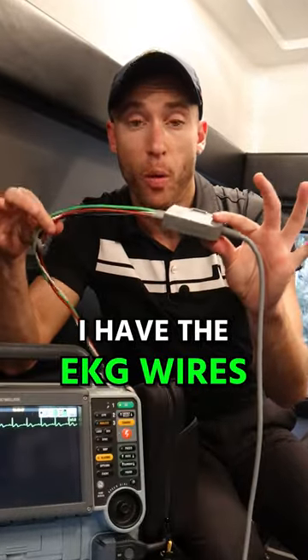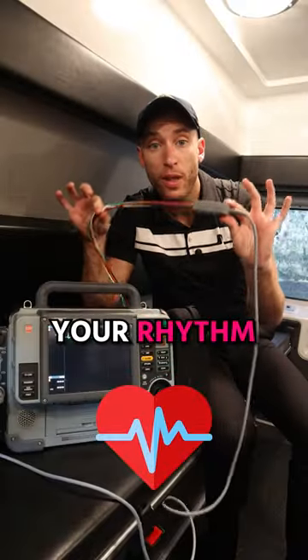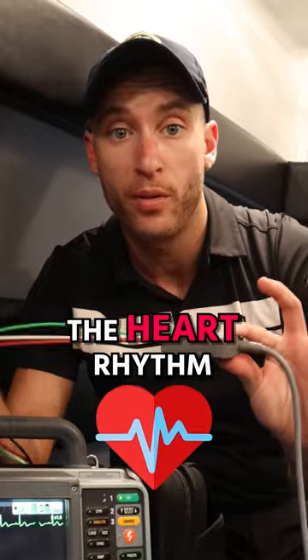Right here I have the EKG wires. This is going to get the heart rhythm off the patient.